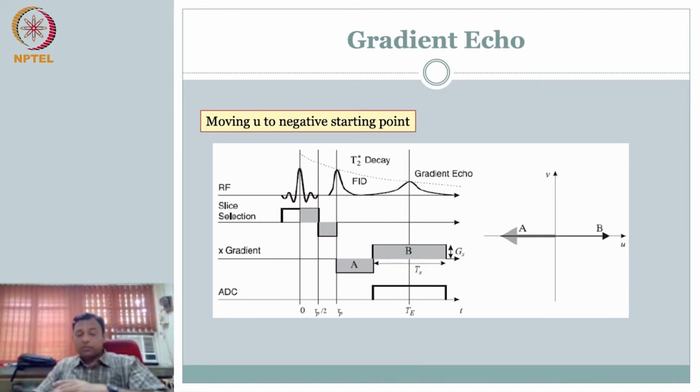Remember, distinguish this from the spin echo that we did. Fundamental difference. There also it was the same idea, right? It was dephasing, you made it rephasing, you got the echo signal, so we called it echo. But that rephasing started because of applying an RF pulse that flipped by 180 degrees. Clear? So your dephasing was happening because of spin-spin interaction.